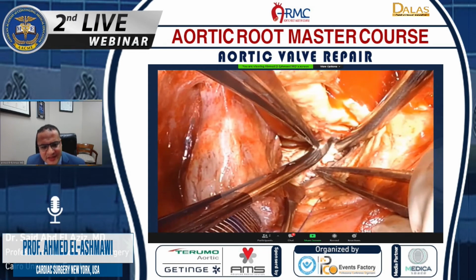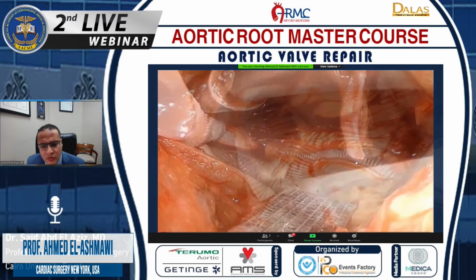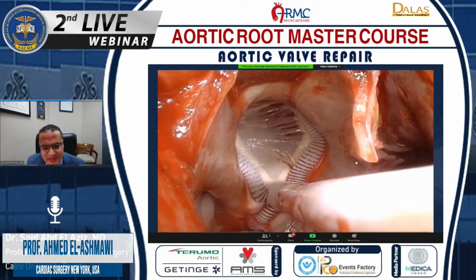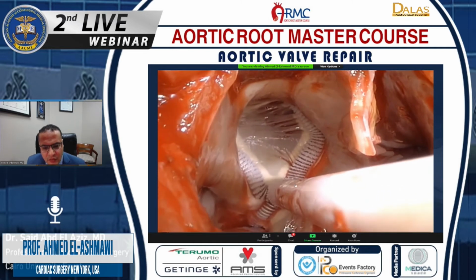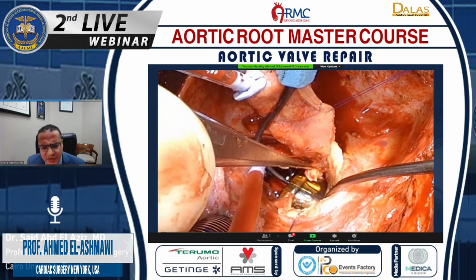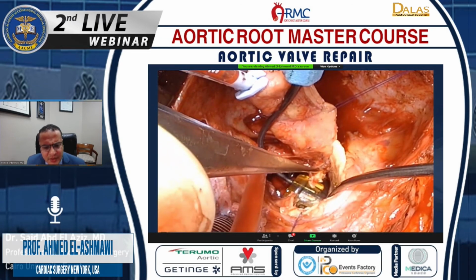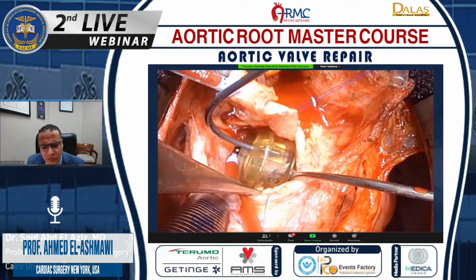Because this patient had atrial fibrillation and high risk for stroke, we did a cryomaze ablation through the dome of the left atrium. We had a fantastic exposure here. As you can tell, the whole middle of the heart is open. We sized the mitral valve, and you can definitely oversize the valve. This was a 31 Magna pericardial valve, which we thought would be a good size.